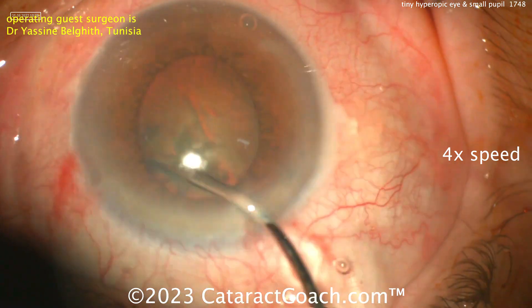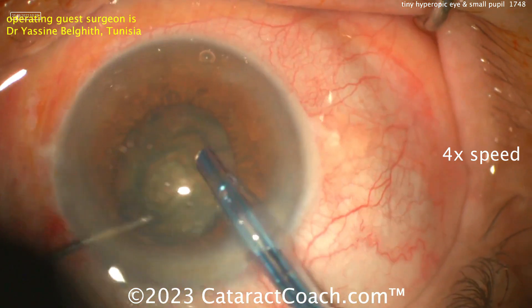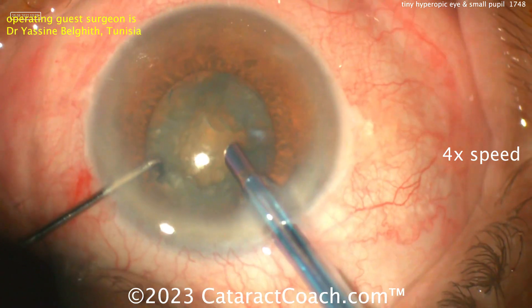There's no room to prolapse it — don't try to pull it out of the bag. This is a dense nucleus in a very tiny eye with a small, shallow anterior chamber. We have a very experienced surgeon here — and there's a Rosatelli-type spin there.